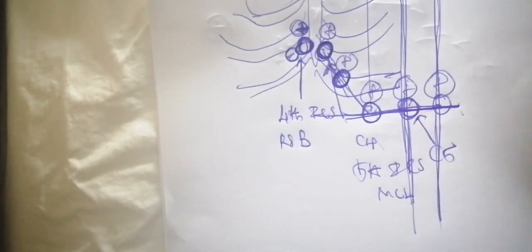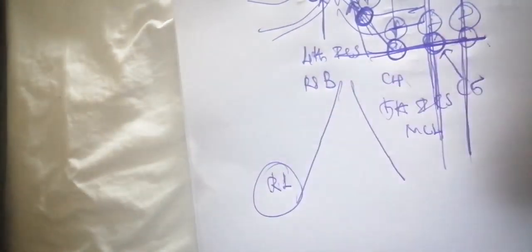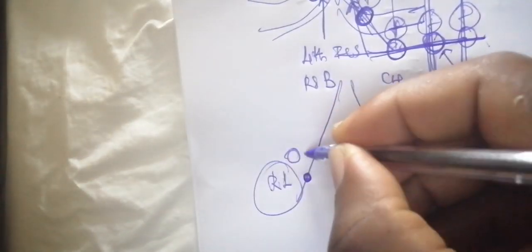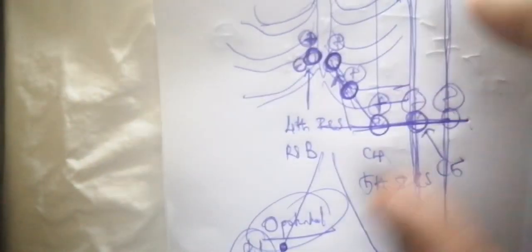But in physics this is impossible. Every time that you have a positive, you must have a potential that is comparatively negative to it. Is it clear? That's why for the chest leads there is a reference point, and generally the chest leads' reference point is the right lower limb, the right leg or the right foot. So you have a lead which shows the zero potential. That zero potential is the reference point of all these unipolar leads. Is it clear?